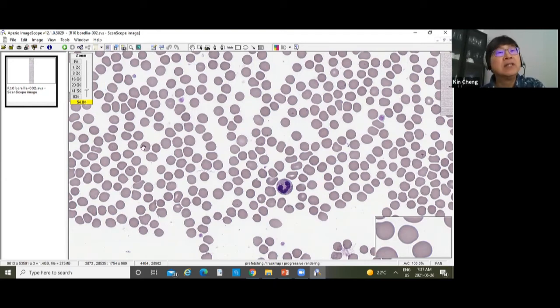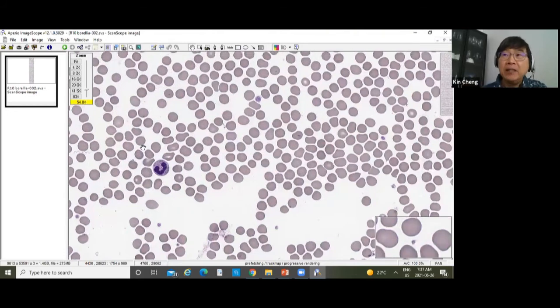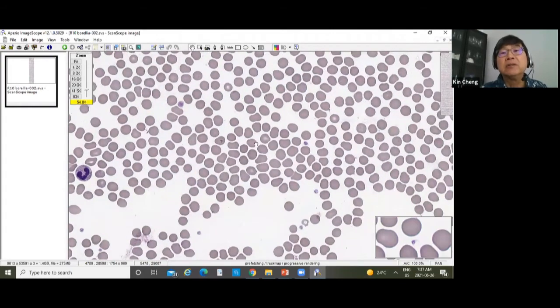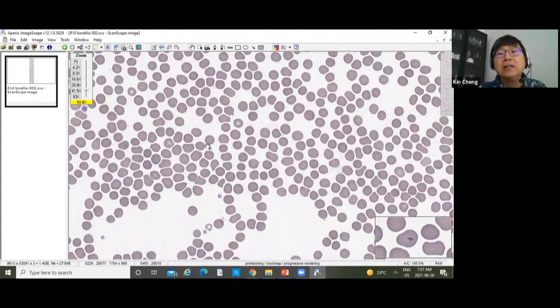But when you scan, usually in my SOP, I have a process for how to do the 10 times scan, what to do with 40x, what to do with 100x. Okay, but I'm not going to go into it. I'm just going to tell you that it's important to do a systematic scan. So when I scan, I would just move along now under 40.